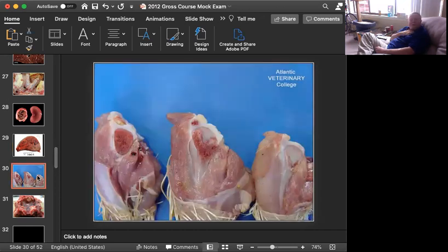Oh, here's another great picture. This is tissue from a chicken, or obviously tissue from multiple chickens, because I don't remember any chickens having three drumsticks. There were some in Ripley's, believe it or not, maybe. But we're going to say these are multiple chickens, and I need a morphologic diagnosis, and I want the name of this condition.